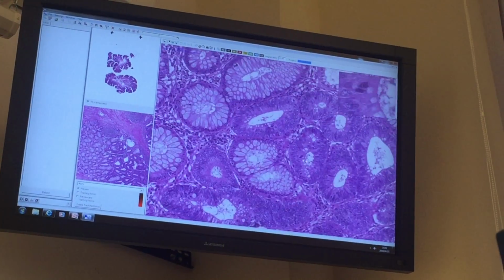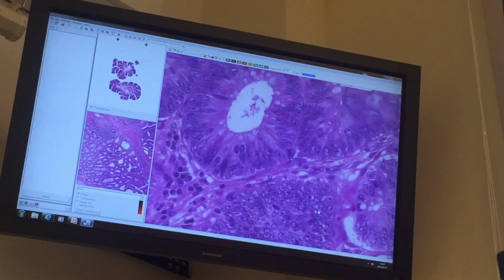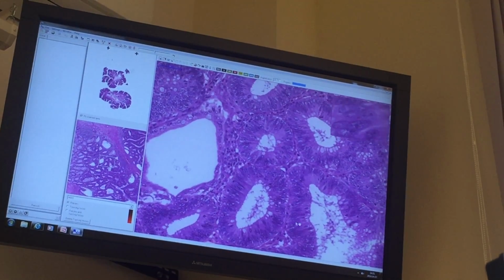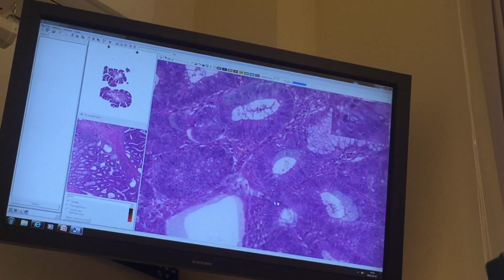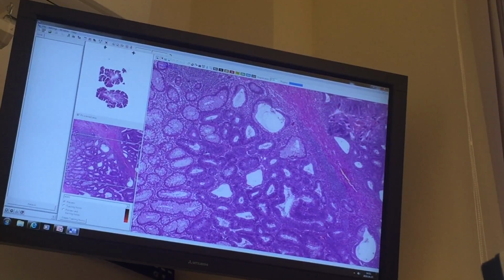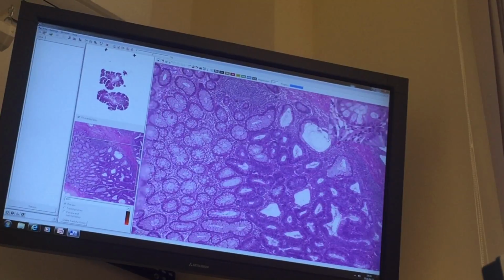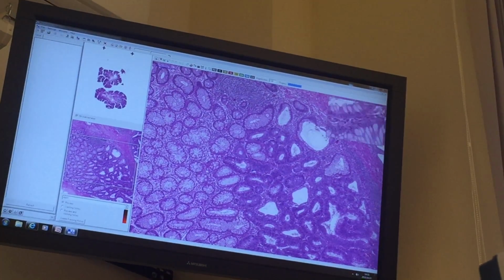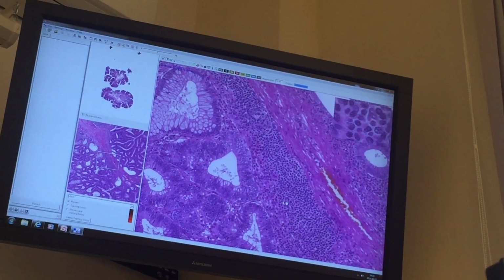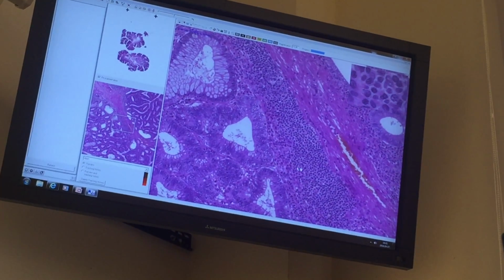And yeah, mitotic figures. There will be a few, or at least elevated compared to a normal mucosa. This dark one is going to be the dysplastic one, and this whitish one is the good one. And in the lamina propria you can see the inflammation because the surface of these polyps is usually ulcerated.